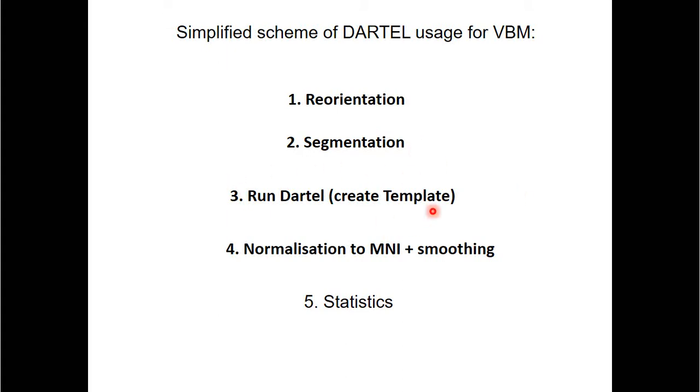Then you run DARTEL to create a template. You create a template which is local priors for tissue classes for this specific group, local group.